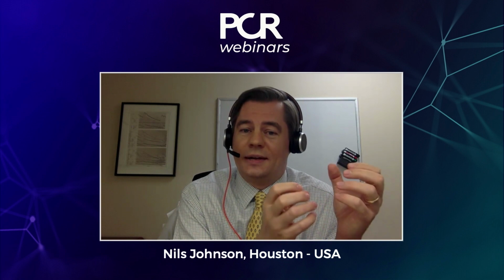What do you do? Right, so there are 2 different scenarios, right? One scenario is where the resting measurement says that there's not much gradient, but yet when you give hyperemia, there's a very big gradient, right? That's the opposite of the kind of case that I showed. And there I think we have to ask the question, well, what do you think is causing the patient's symptoms, right? The patient's not having symptoms when he or she is just sitting there relaxed on the cath lab table. And so I would argue that the stress measurements in that case let you understand what's probably happening when the patient is out walking or doing stairs or whatever activity it is where the patient began to have symptoms.